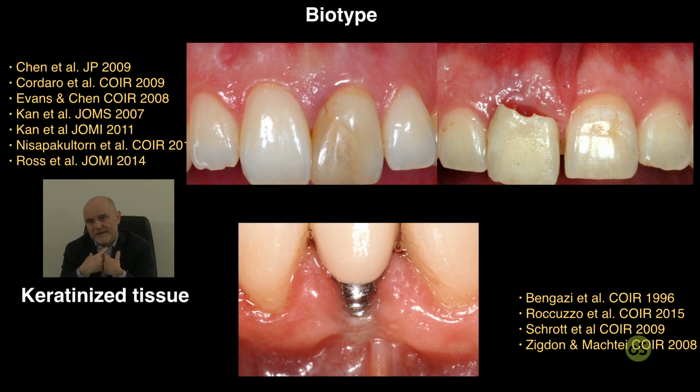When I show you my personal treatment options and diagram of the different treatment options according to the type of tooth extraction, dental or periodontal, I will tell you that the thickness of the soft tissue is a critical aspect to select the surgical approach, but it's even more true that some procedures which we consider very important for preserving bone thickness, like socket preservation, do not give any true help in terms of increasing the soft tissue thickness.